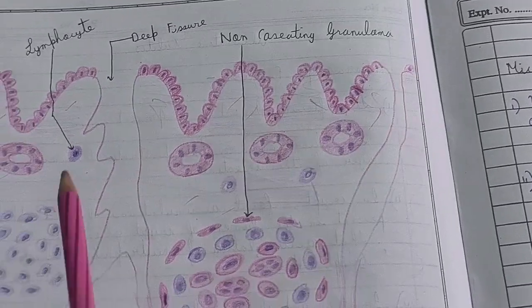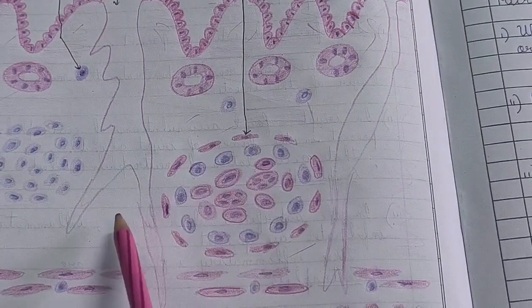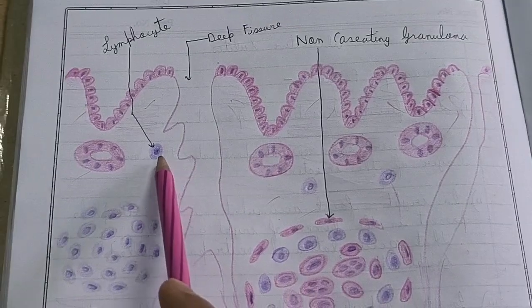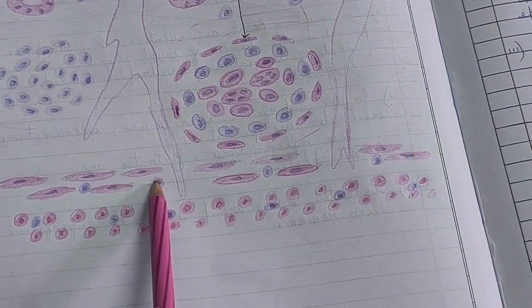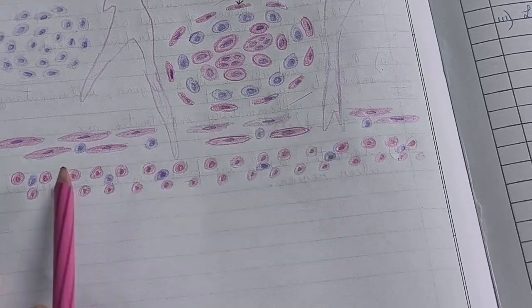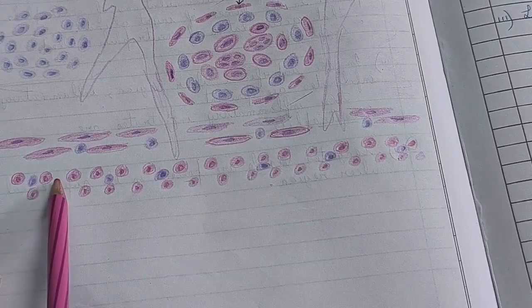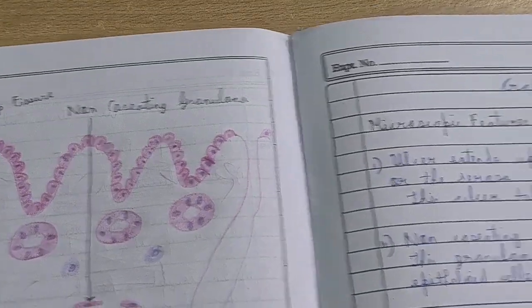And the third thing is that in all the layers lymphocytes are present. This lymphocyte is present in the submucous layer, and this lymphocyte is also present in the muscularis mucosa or muscular layer, and this lymphocyte is also present in the serosa. So these are all the histopathological findings.